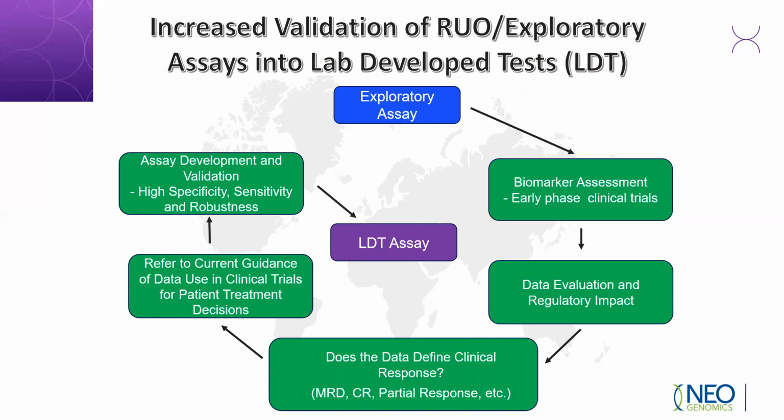If the assay is determined to potentially have an ability to aid patient treatment decisions, then this additional validation will be needed to ensure accuracy, linearity, and limit of detection, to name a few, before it fully becomes a lab-developed test or something to be used for patient treatment.